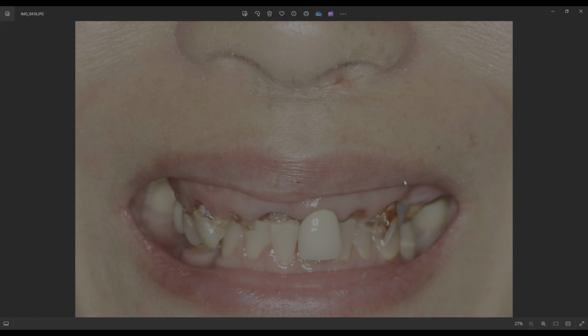So one of the things that's very important is, if I'm going to make your job easier, Dr. Koukousaki, I've got to make sure I reduce that bone. And I know every day it stresses you out, right? Seriously. So it's very important that we reduce that bone. But Dr. Koo, we know that when we do that bone reduction, when we take out that bone, and you have a patient that already has huge sinuses, we don't have that much bone to engage. Correct. Right? It becomes very challenging for us. Yeah, long story short, it makes our surgery a lot more stressful, right?